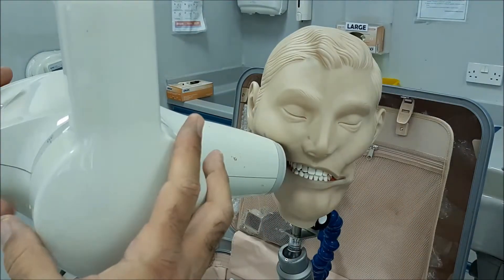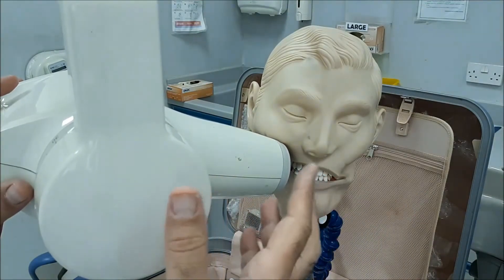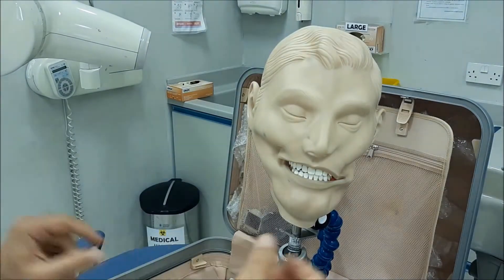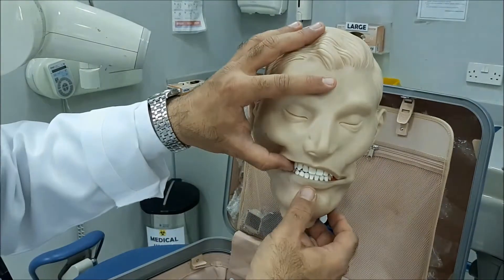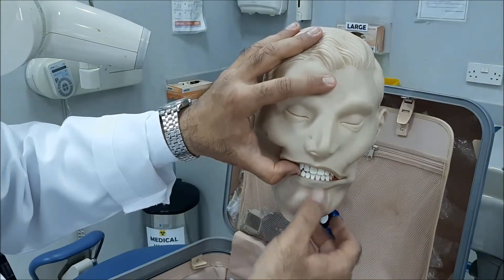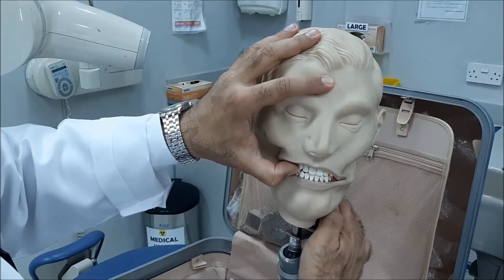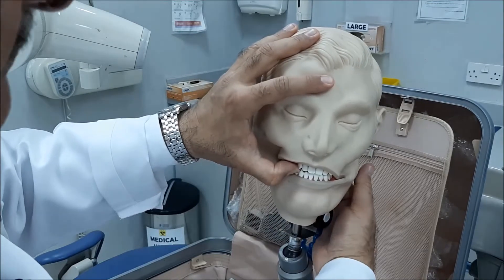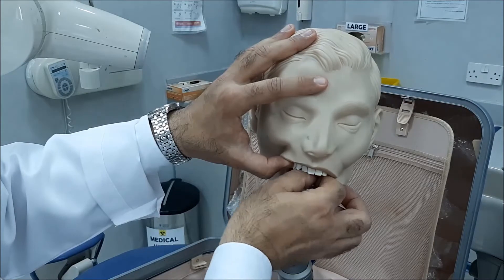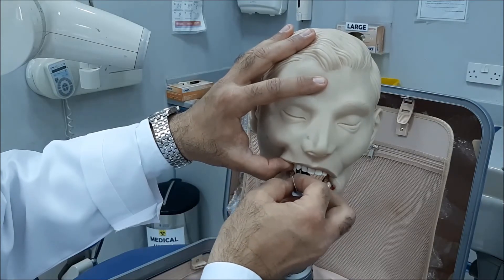Once you are done, remove the x-ray cone, support the film from the tab, ask the patient to open, and take the film out of the oral cavity.